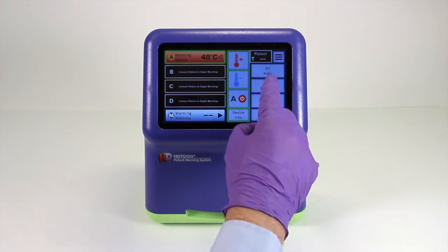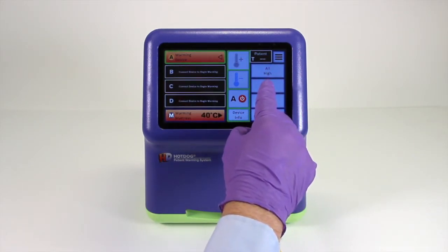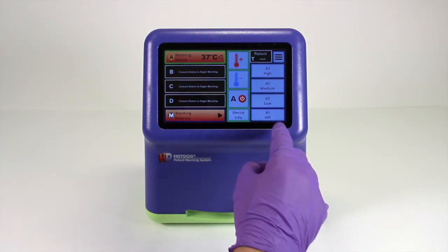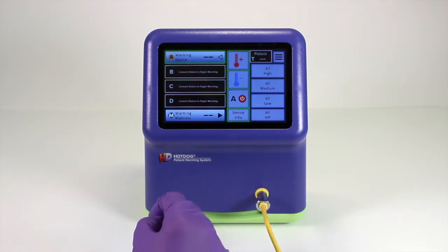If you have multiple devices connected, such as a mattress and several blankets, you can raise or lower the temperature of all of them at the same time simply using the icons on the right: all high, all medium, all low, or all off.